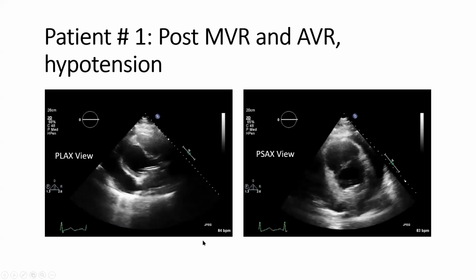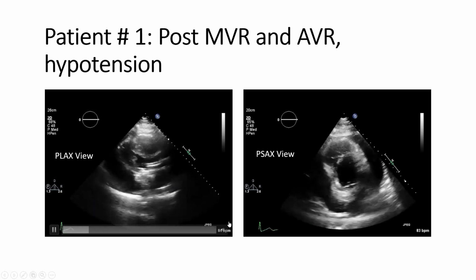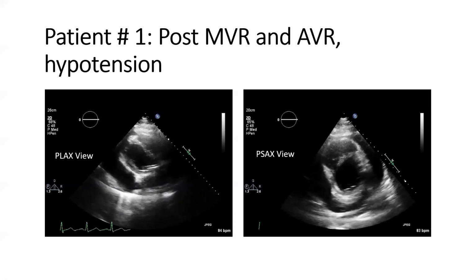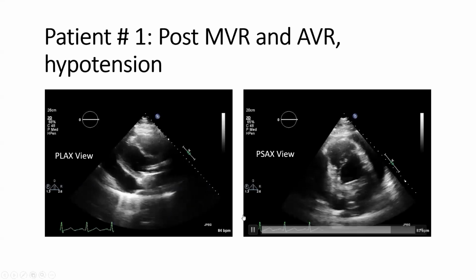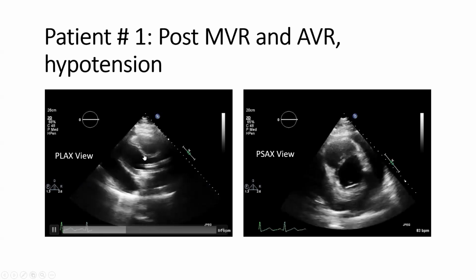Now, I cannot see the chat box, so I will assume that somebody is looking at it. If you look at the way the septum is, pardon me? I am looking at it, and septal flattening, LV collapse. That's what people are putting in the chat box. Yeah, I'm really glad that you looked at the very abnormal fashion in which the septum is moving.